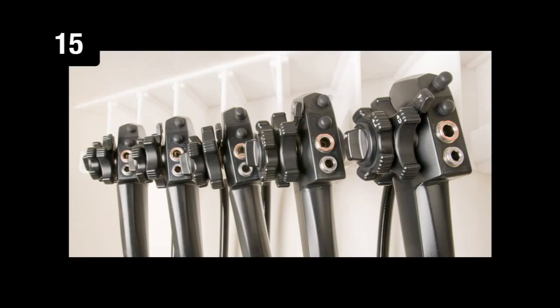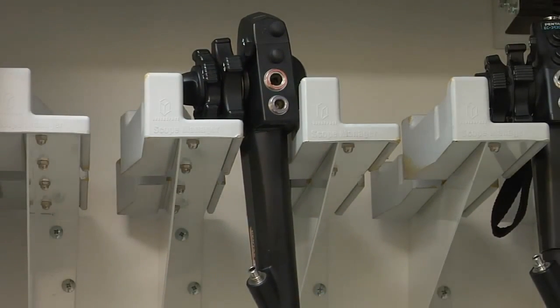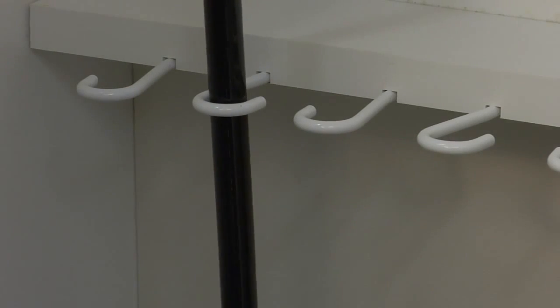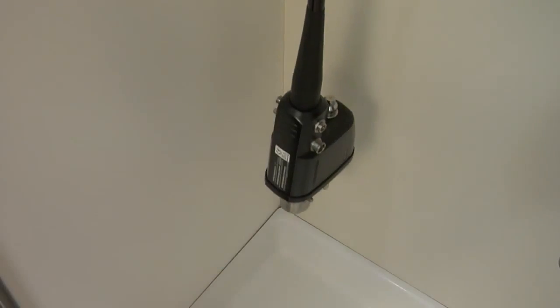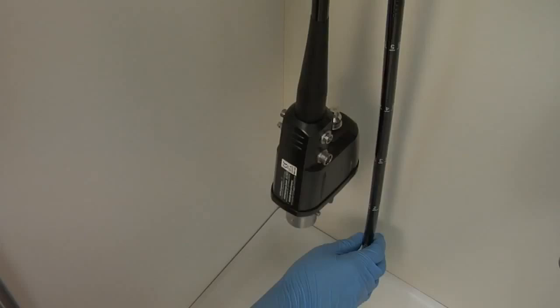Step 15. Store the endoscope. After alcohol rinse, air dry endoscope channels and remove all components to facilitate drying and prevent bacterial buildup inside the instrument. Store the endoscope by hanging it in a dust-free, well-ventilated cabinet with the soaking cap off, and store the valves and the other removable components separately from the endoscope.